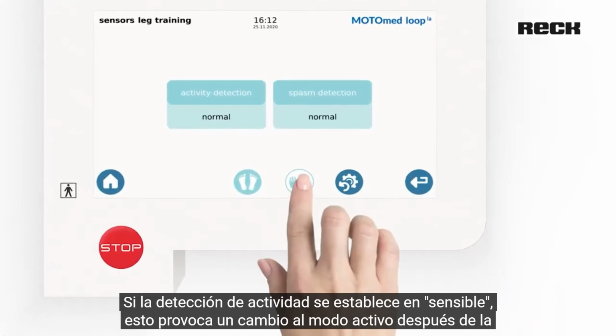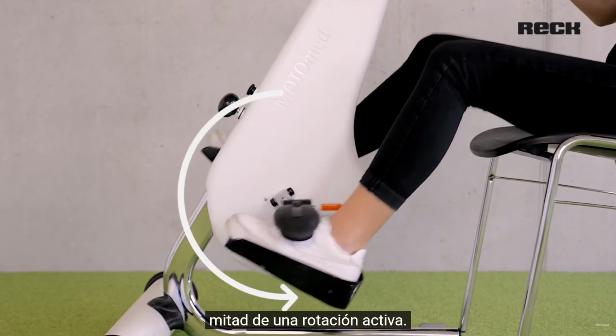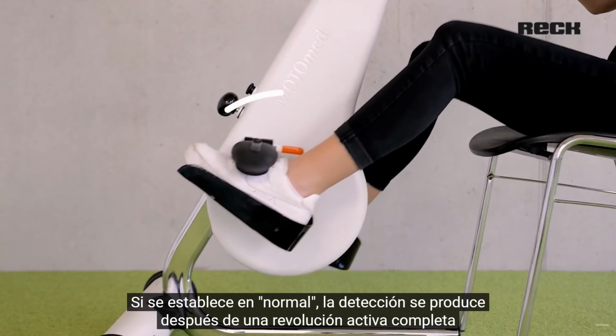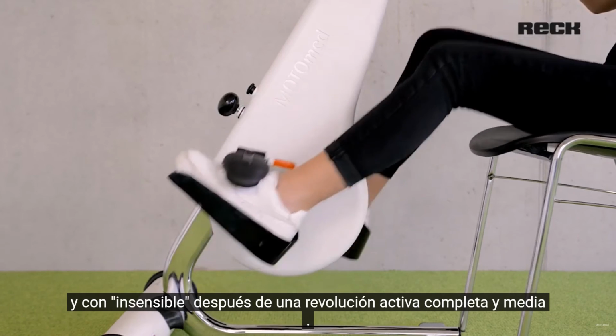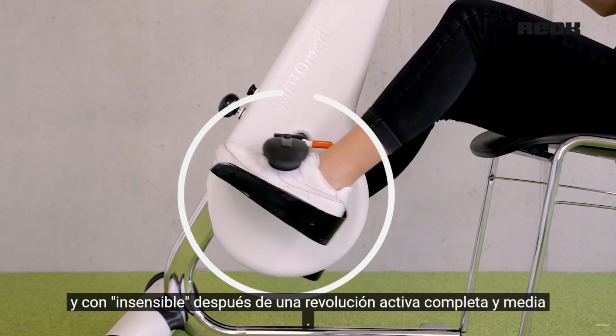If the activity detection is set to Sensitive, this causes a change to active mode after half an active rotation. If set to Normal, the detection takes place after one complete active revolution, and with Insensitive, after 1.5 complete active revolutions.